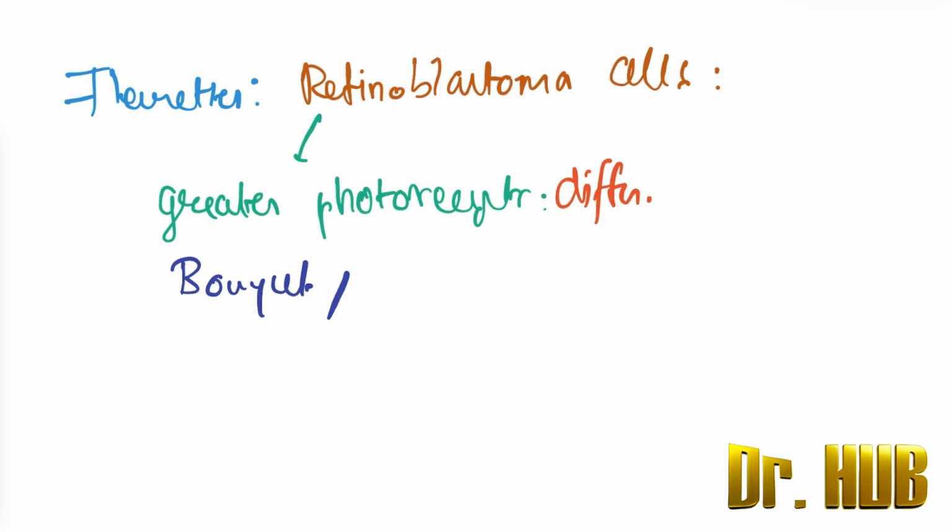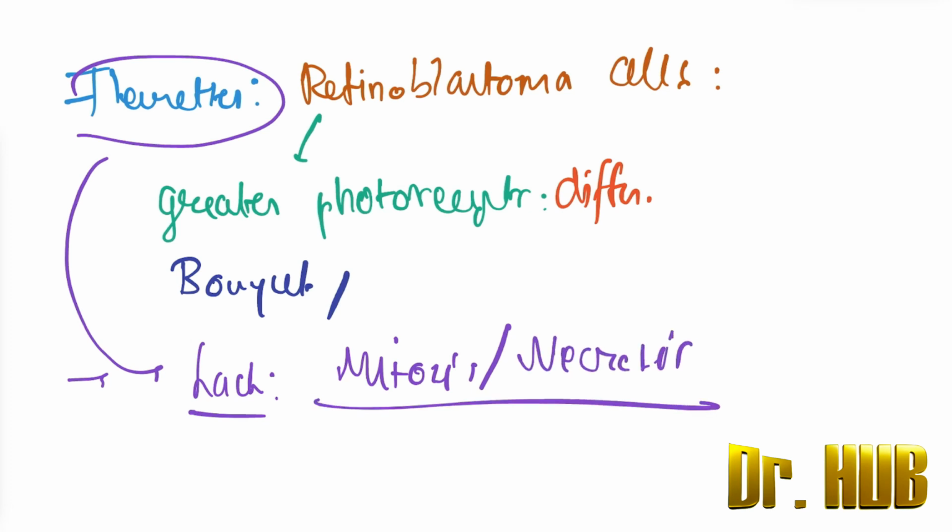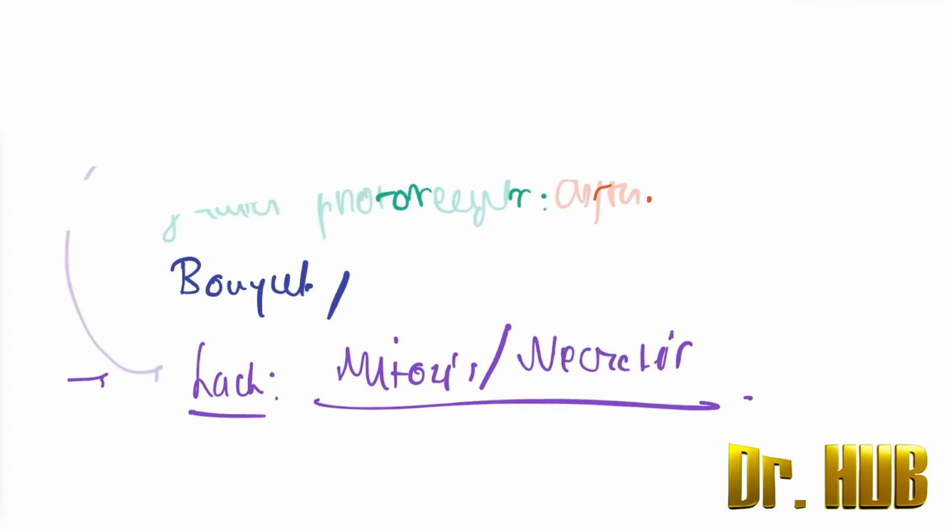The fleurettes lack mitosis or necrosis.